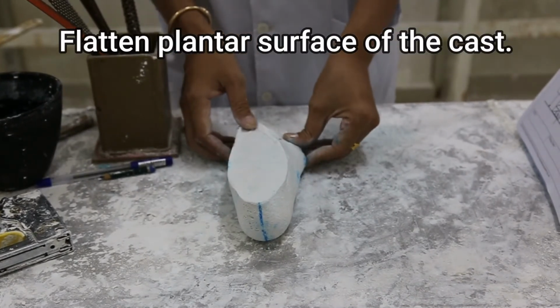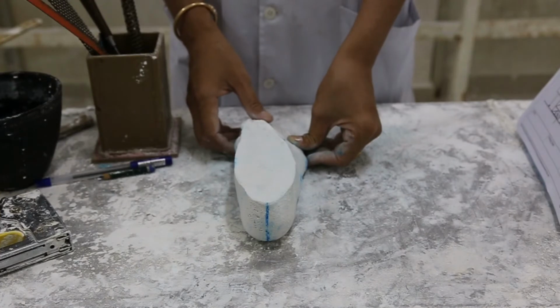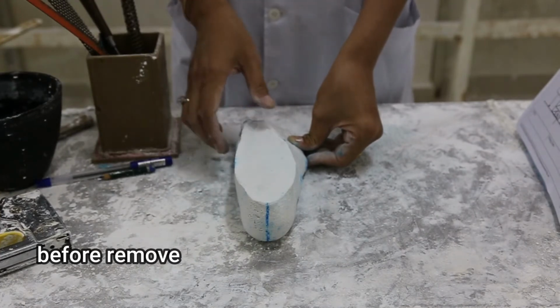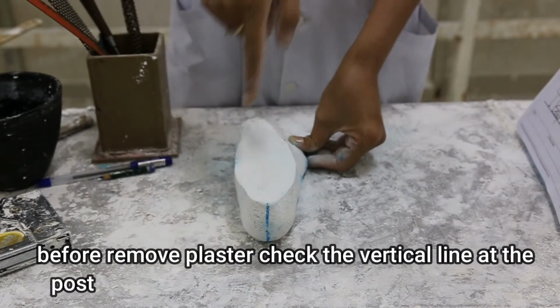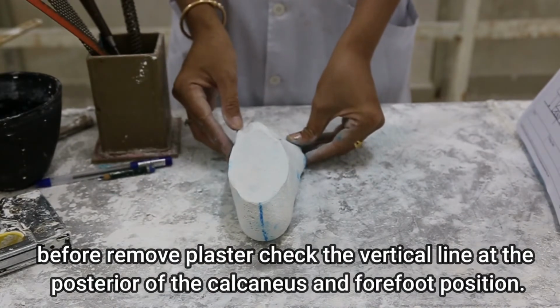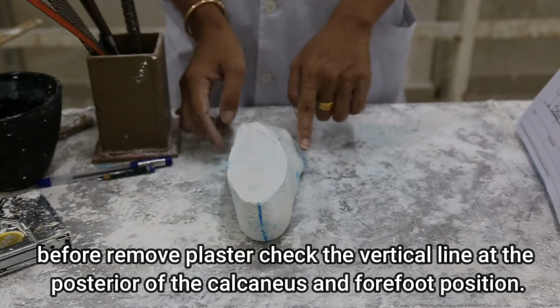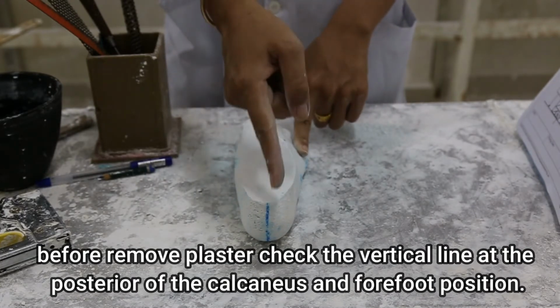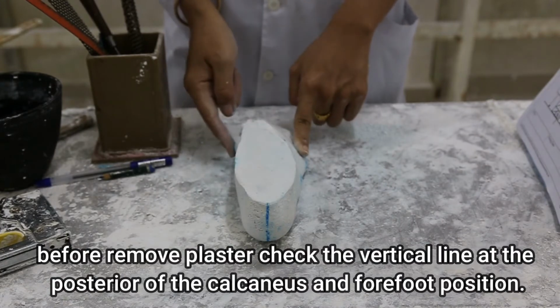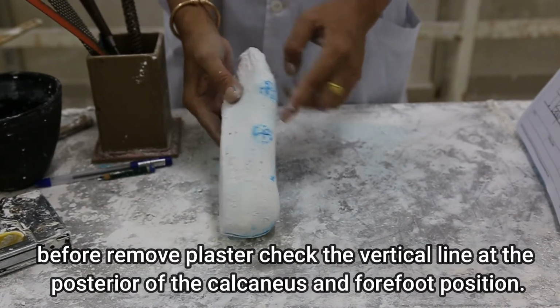For the next step, before we flatten the plantar surface of the foot, we need to identify how the plumb line is at the posterior of the calcaneus. So in my mold, the alignment is not really correct. When we press at the lateral side, the alignment is correct. So it means that I'm going to reduce at the lateral side of the plantar surface. Okay.